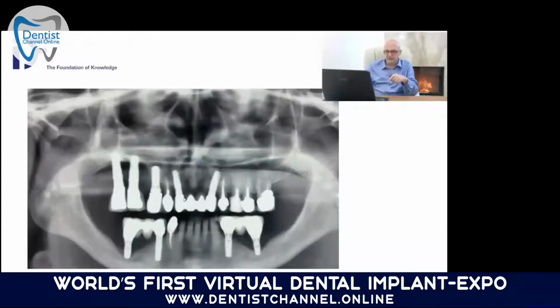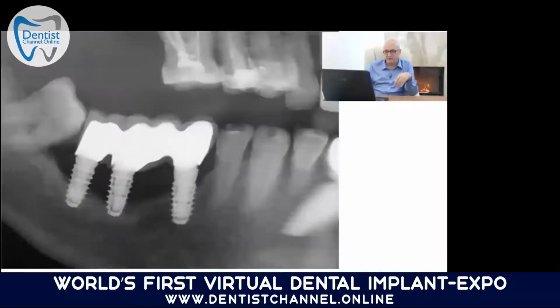And as you see here in the front, as I mentioned before, especially because there are teeth next to it, we don't see bone loss and we don't see peri-implantitis. So peri-implantitis creates itself in areas where we have total edentulism, so there are no teeth holding the level of the bone. Then the level of the bone goes down, and then we see peri-implantitis.